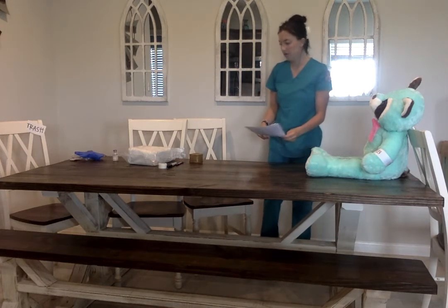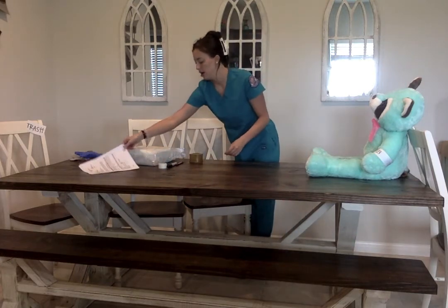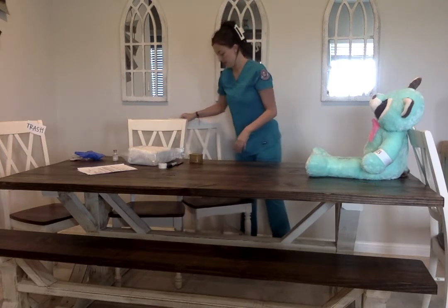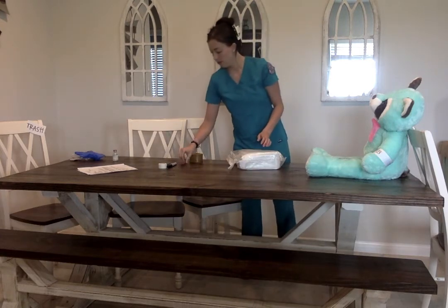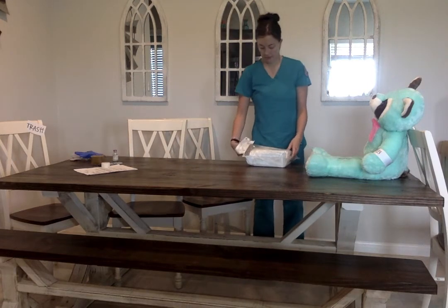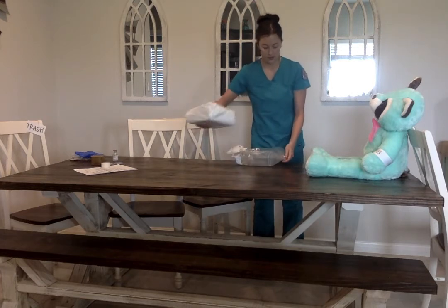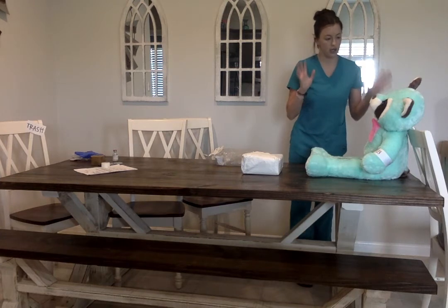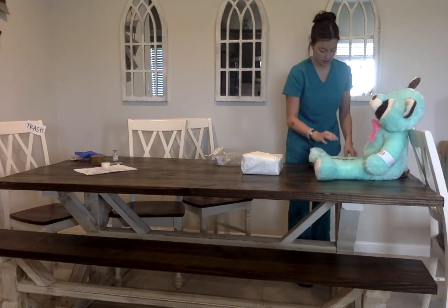Okay, Mr. Perez, now I'm going to insert a foley catheter. Let's remove that. Here we go. And I'm going to make sure you're in the correct position, dorsal recumbent with your knees bent.